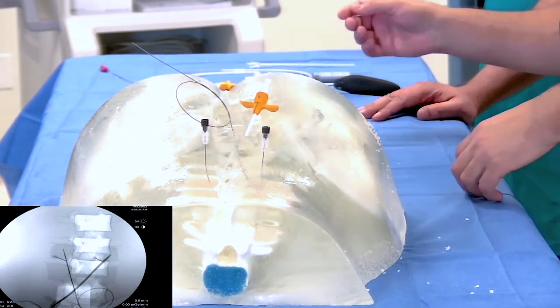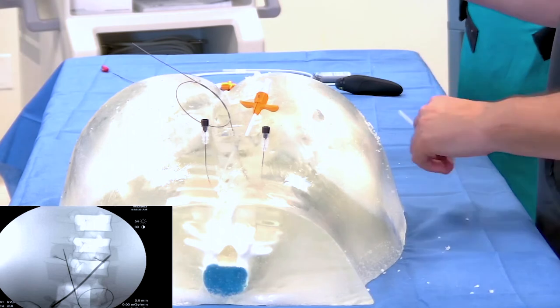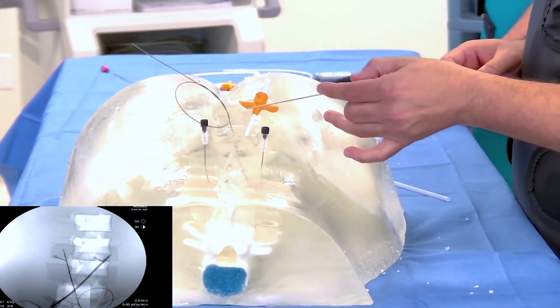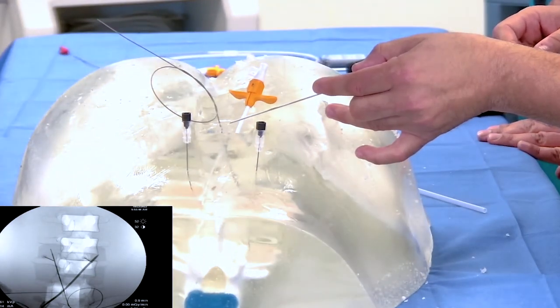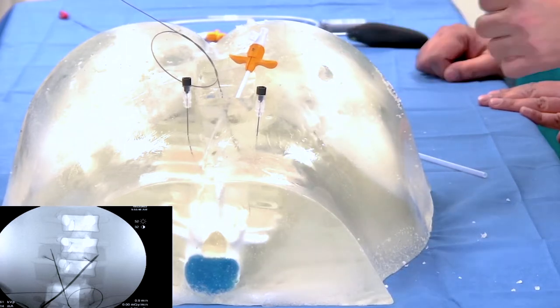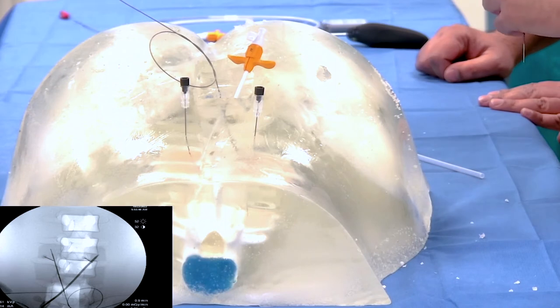The next step — we take this 18-gauge needle and find our starting spot, which is right over the spinous process of the level below. Since we're at the L3 transverse process, that's going to be the spinous process of L4. We take the angle from that point and do a cut-down — just like an SCS cut-down — not because you're putting anchors in, but because you're going to make a strain relief loop.